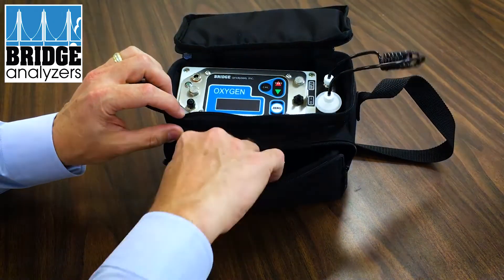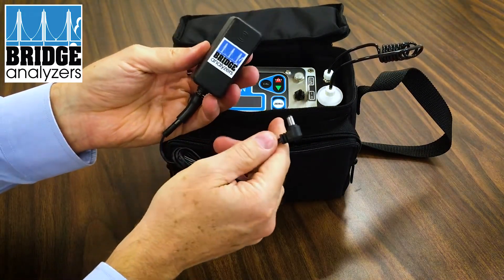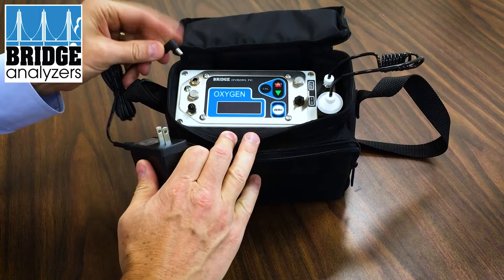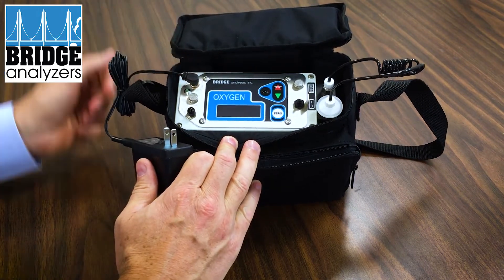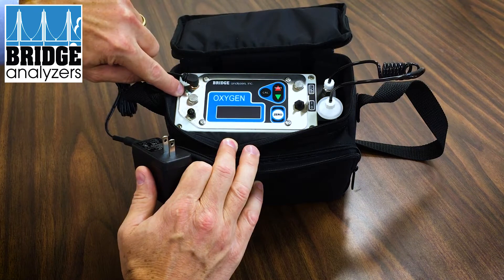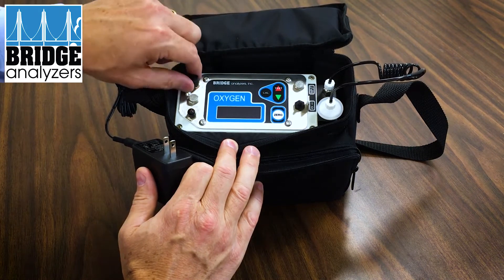You'll also receive a power adapter, which we've been labeling with our name on it so you know that this power adapter goes with the bridge analyzer. When it's plugged in, you can plug in the analyzer here to recharge the batteries. When you have it charging, it'll light the LED right underneath the power socket.